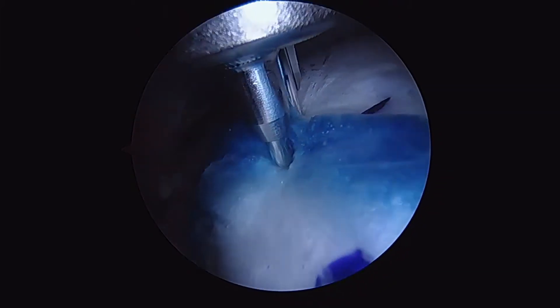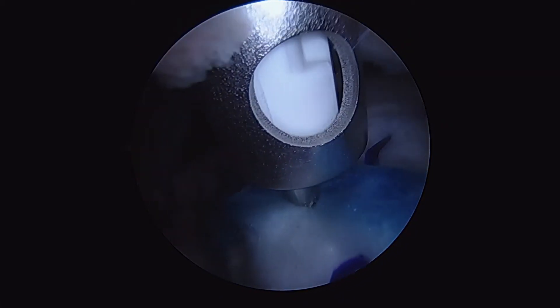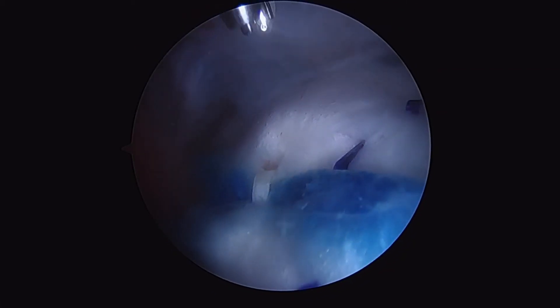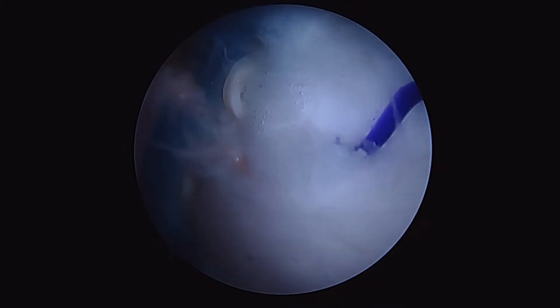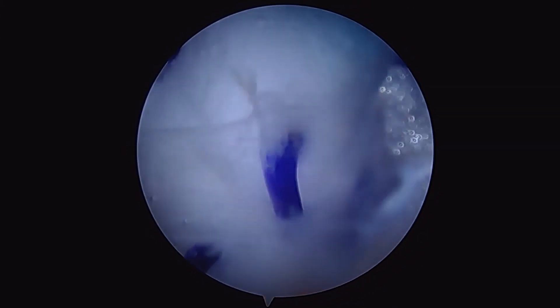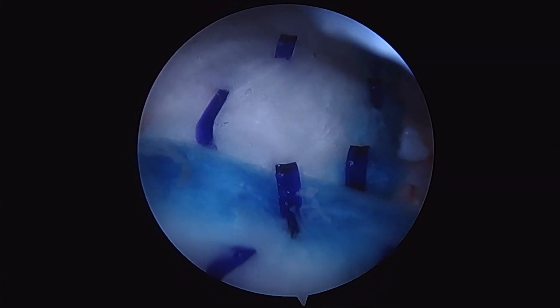Once we've got that secured, we're going to go ahead and bridge our grafts together first with our non-absorbable staple. Then we'll bridge our grafts with an absorbable staple and complete our repair of a massive tissue deficiency in this rotator cuff from calcific tendonitis.